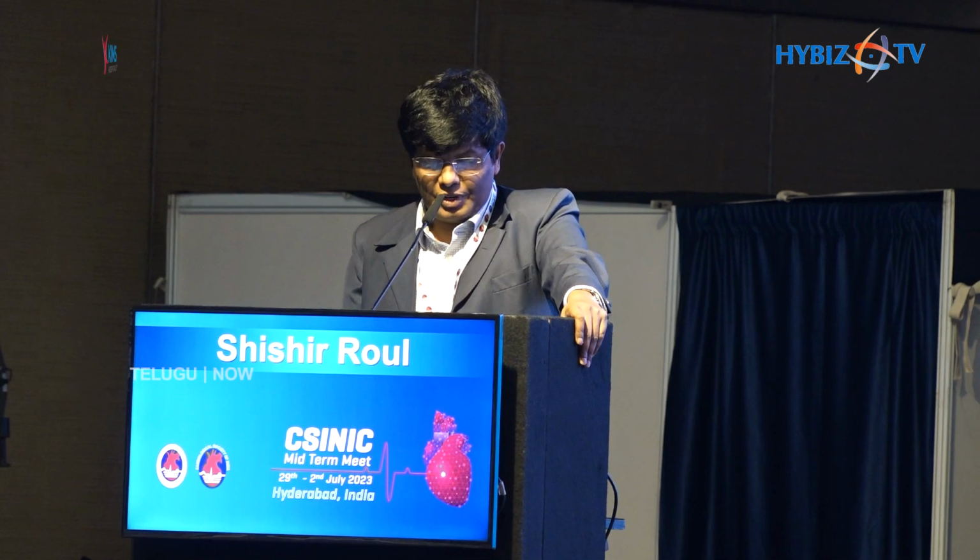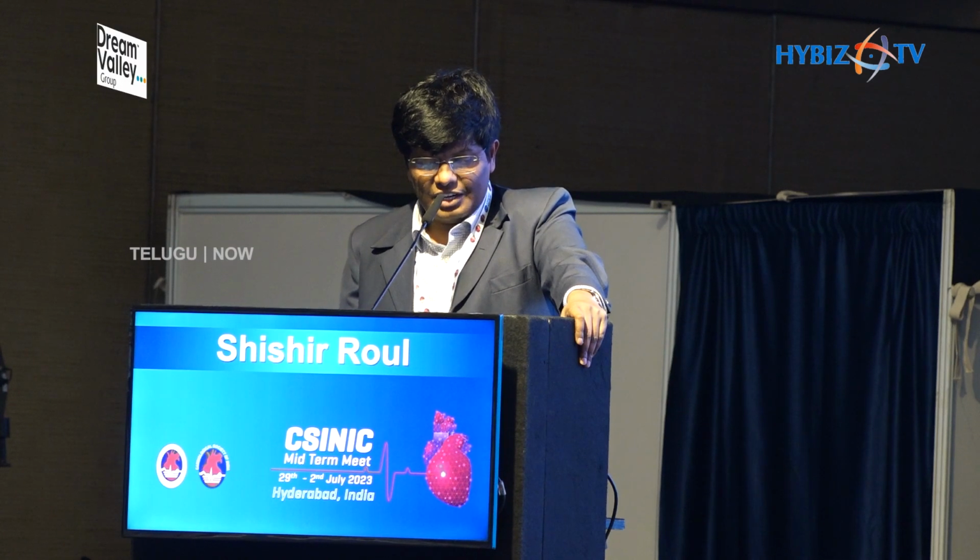So the take-home message: stent dissection is a procedural complication, but it may lead to a malignant course, and imaging plays a greater role. Stick to the basics and never overstretch, because better is the enemy of good. And this is the last line we need to keep in mind: if you fail to prepare, be prepared to fail. Thank you.